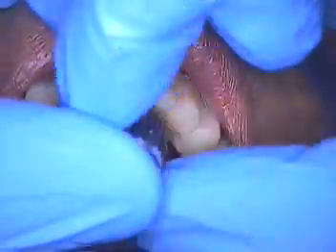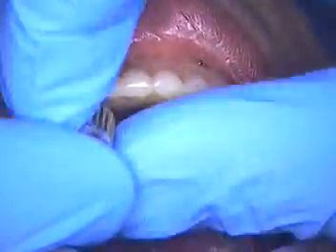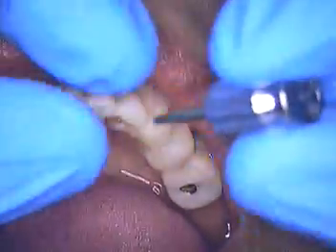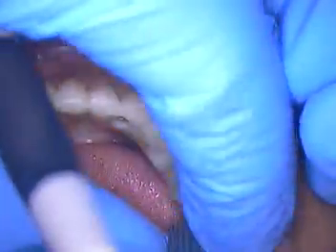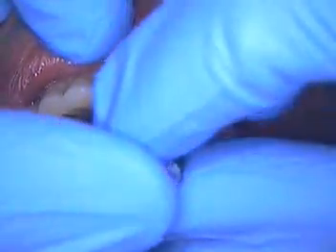This is a Nobel BioCare case. And these are multi-unit abutments that have been in place for some time. We started the case in April of this year, and we've gone through a number of try-ins, of which all were very successful. Our impression was originally designed so that it was joined together. All the impression copings were joined together at the impression face. So we did an open tray technique, and then after that we did a try-in and verification jig, and we're just walking you through the final steps here.